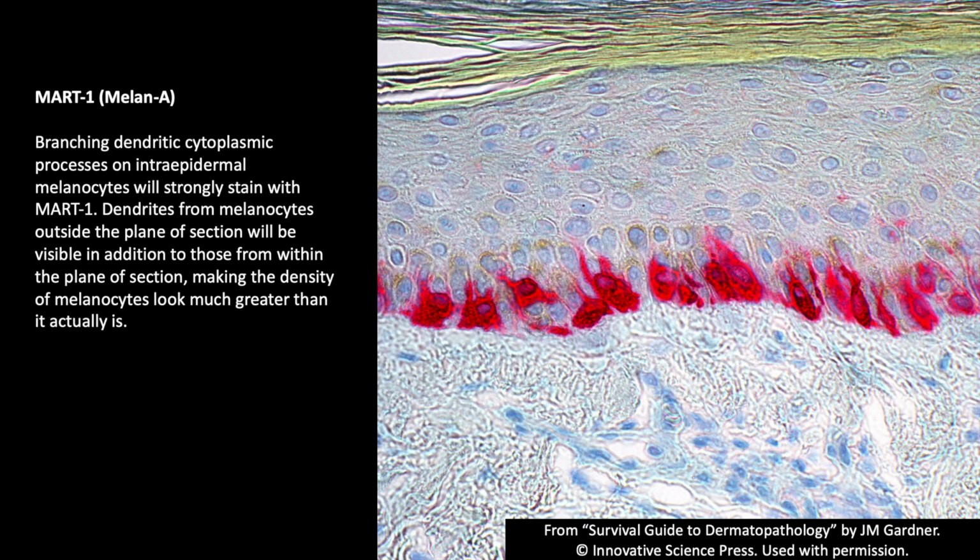The reason I caution against using MART1, and again, a lot of dermpaths, especially I feel that dermpaths who trained maybe more than 10 years ago, are more often using MART1 because MART1 was around before SOX10 had been discovered and made commercially available. So I used MITF in my fellowship, and then early in my practice had access to SOX10, so I got more comfortable with using that. If you already know how to use MART1 and are comfortable with your threshold for how to evaluate it, then great, keep doing it. But if you're just starting out, I would recommend trying to use SOX10. I think it tends to be an easier way to evaluate.